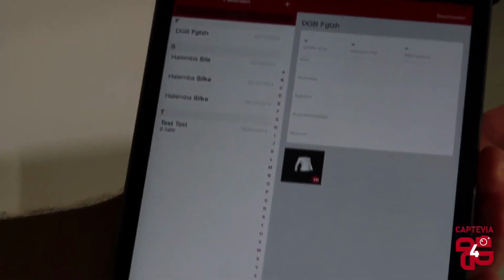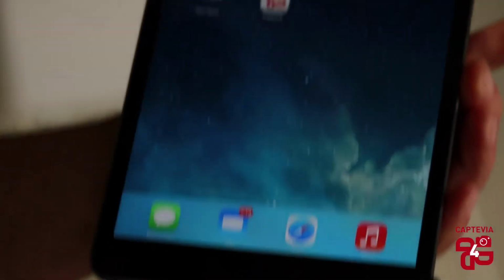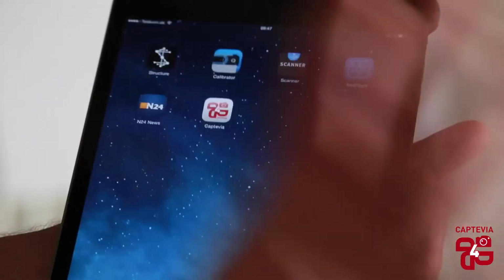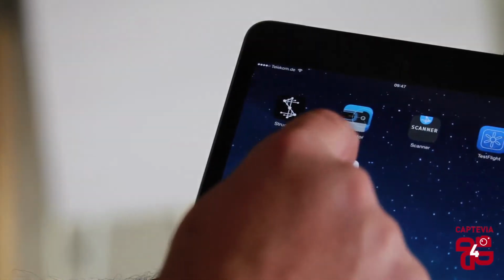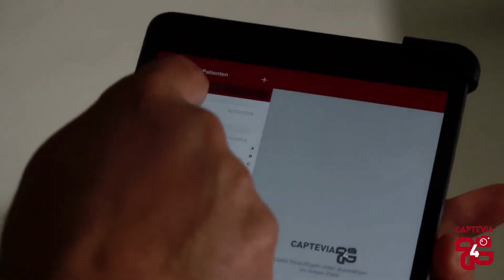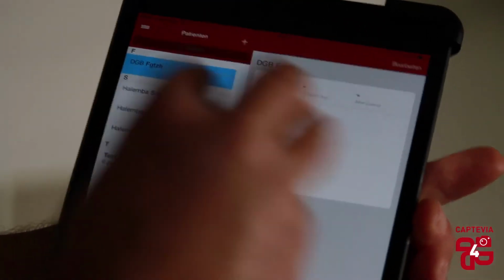After this, you just switch off the app and it's finished. Everything is saved inside, and so we can check again what we have already, and you will see now the same, and it's stored.